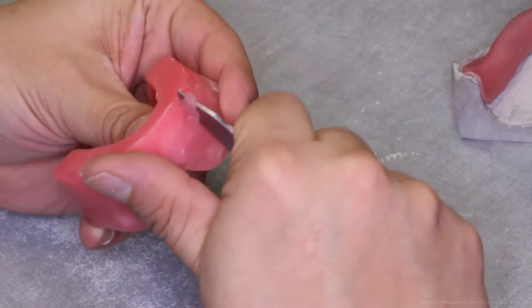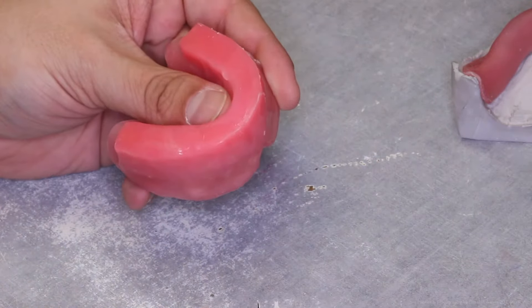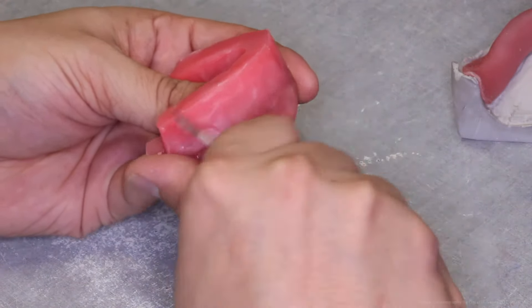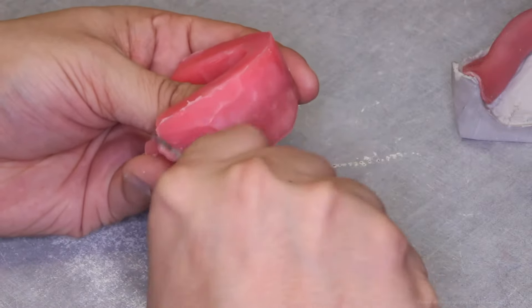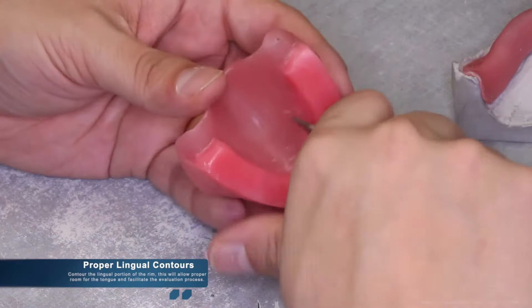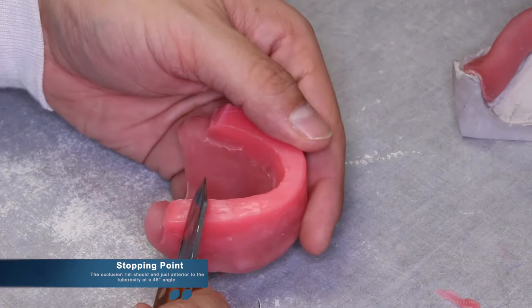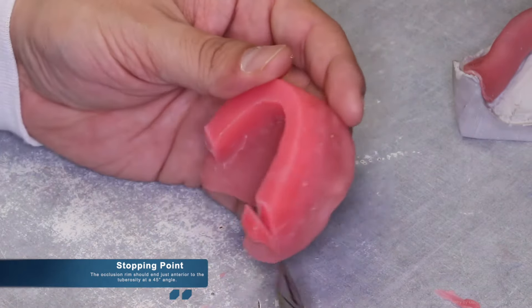It should be noted that widths are a matter of preference. Although the Air Force manual states specific measurements of 8 and 10 millimeters, depending on the school of thought these measurements do vary. Proper lingual contours are also important — contouring the lingual portion of the rim will allow for proper room for the tongue and facilitate the evaluation process. The end of the occlusion rim should terminate just anterior to the tuberosity on the maxillary at a 45 degree angle.